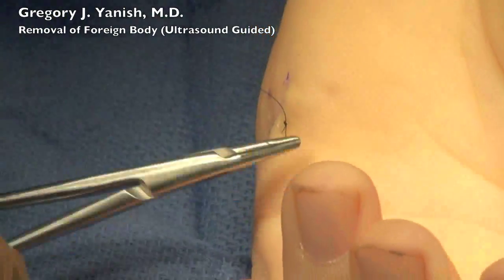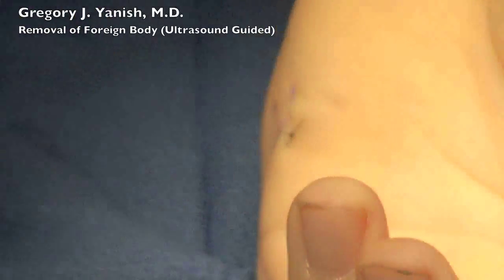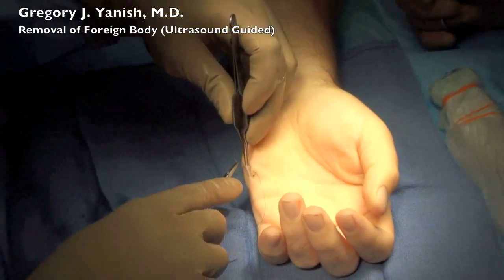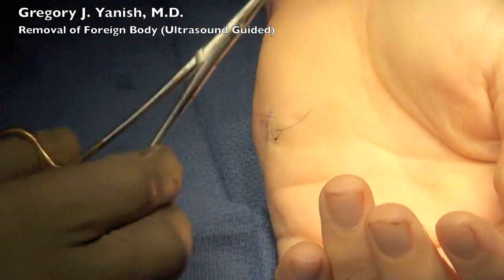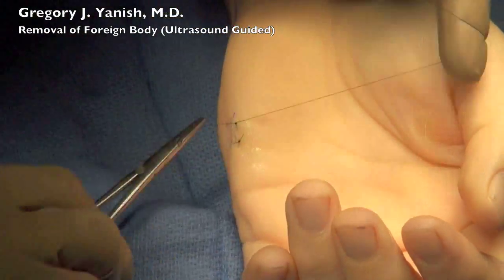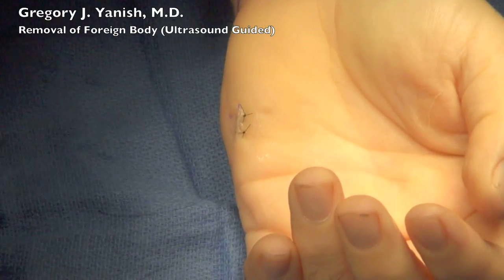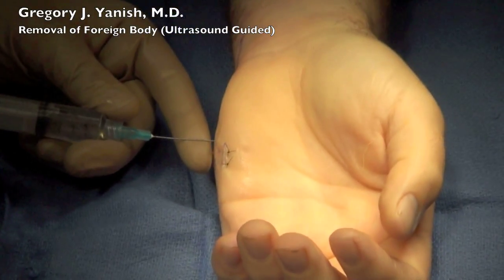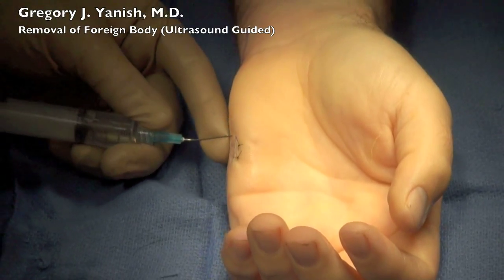This is called a horizontal mattress suture, which allows the skin edges to pucker and creates a better surgical scar. Some local anesthetic is then placed in the wound for post-operative comfort.